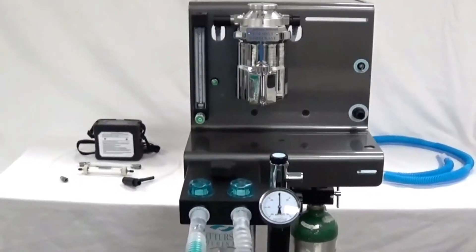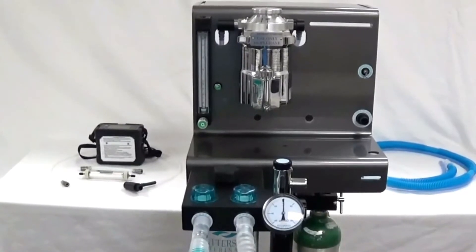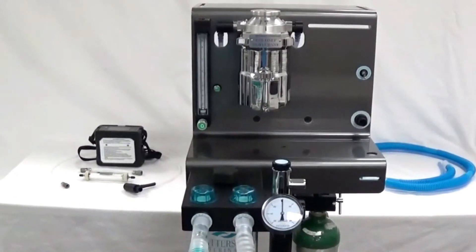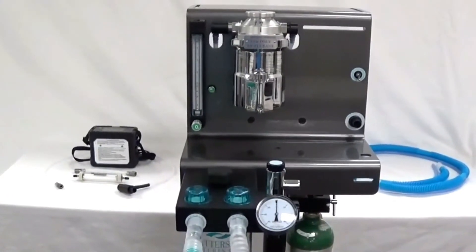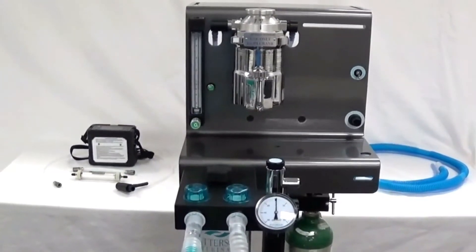This video demonstrates how to verify the output of an anesthetic vaporizer using the Reichen Fi 8000 gas analyzer. We will be using the Versa 2 anesthesia machine and the Tech 3 EX vaporizer.